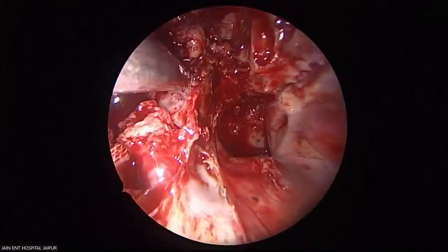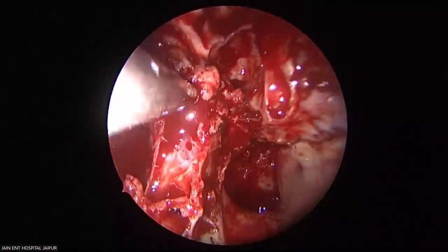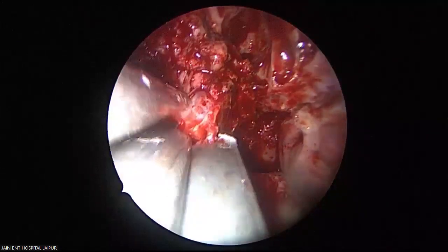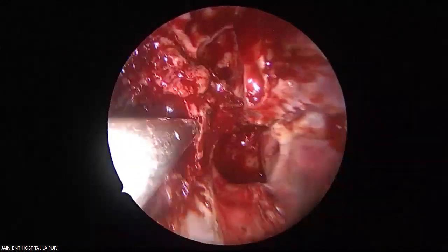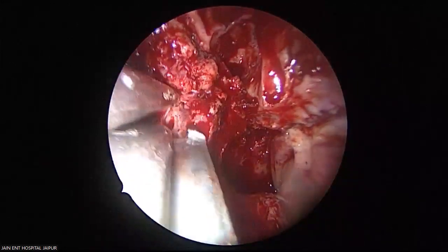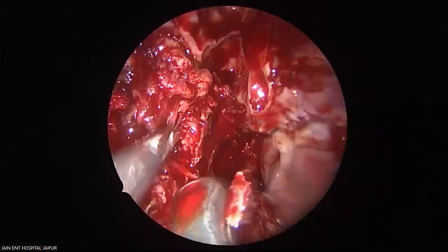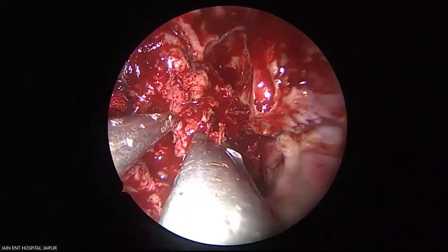First of all, let me open the pterygoid fossa. See this under. I am removing this bone. See the tumor inside the pterygoid fossa. How did I know?